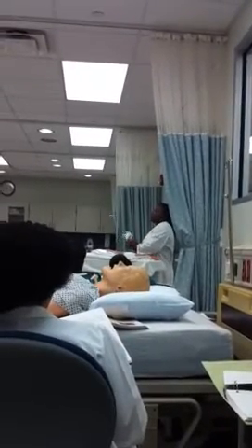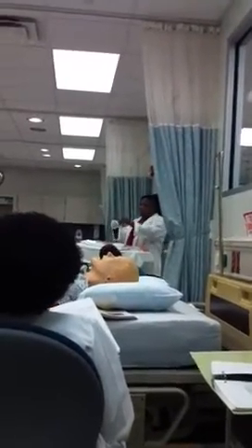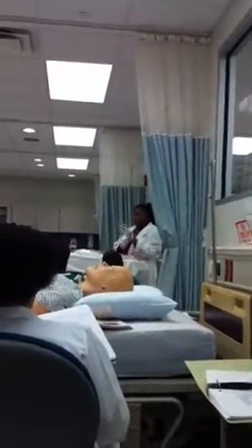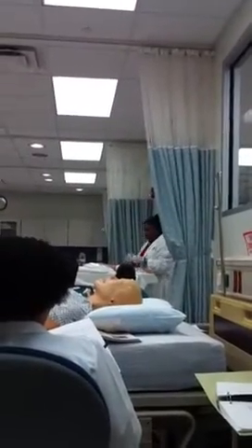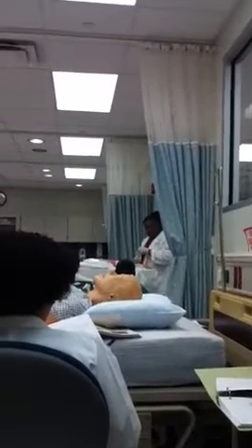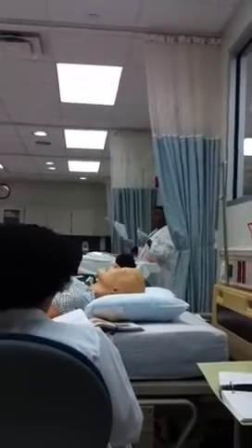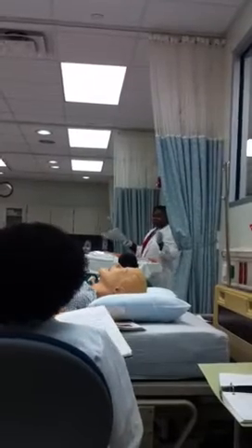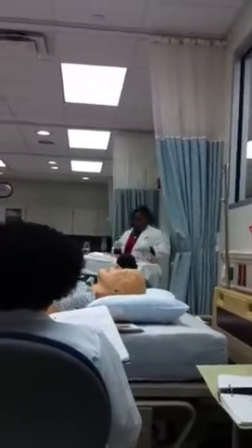I'm not going to go through this whole process again when I demonstrate. It's the same thing, right? So we got it once. I'm just going to go straight into actually giving it. Okay, I have my supplies, I have my insulin. Before I give it, Humulin N, 10 units. My second check. 10 units. All right, let's see.